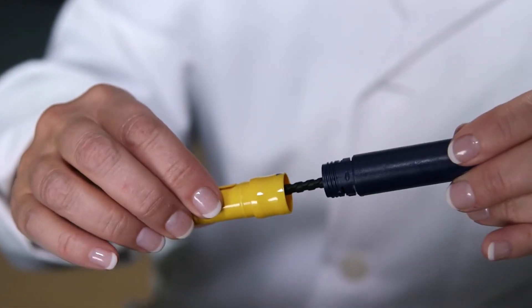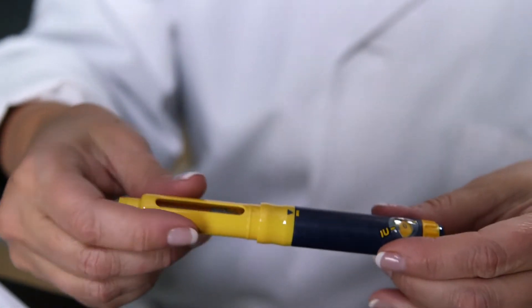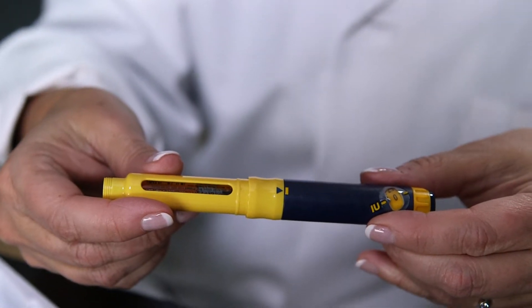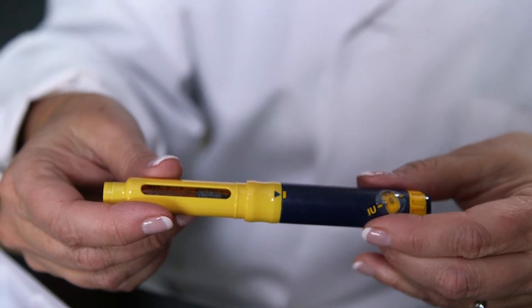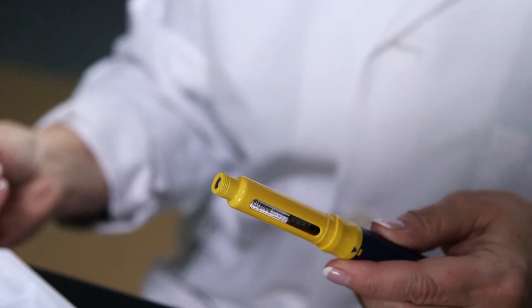You then take the bottom of the pen and screw the pen back together, and you'll see the little symbols line up. You'll then alcohol wipe the threaded ends of the pen and the rubber stopper.